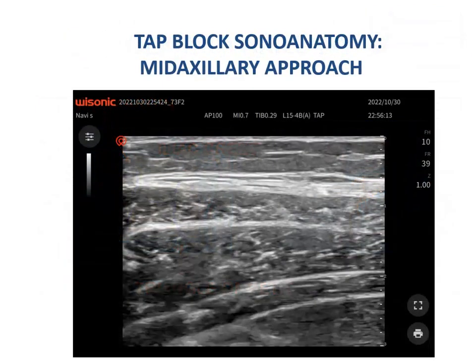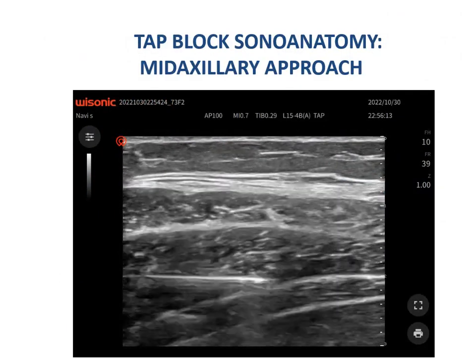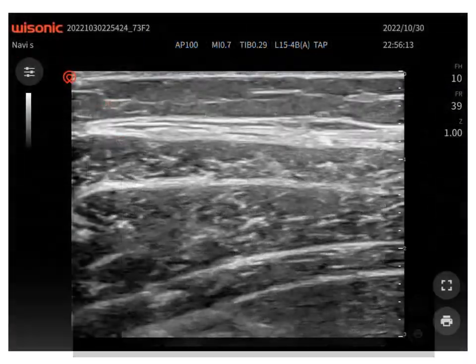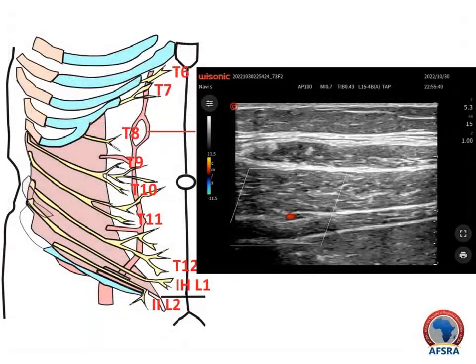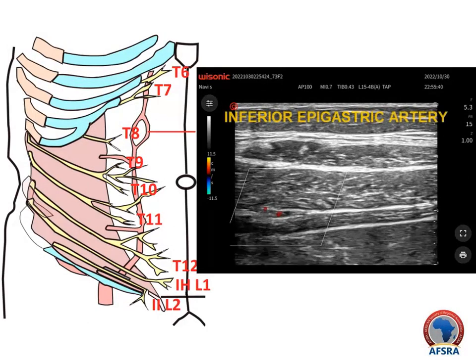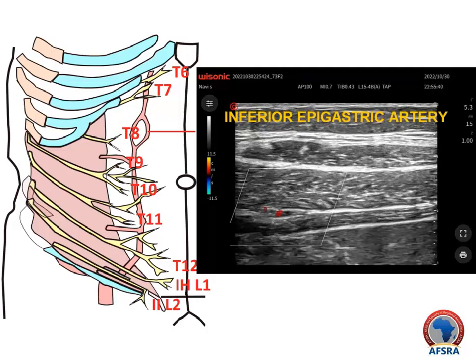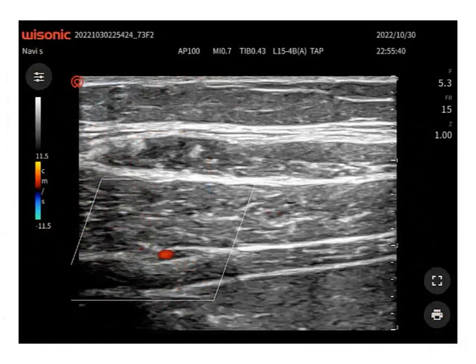The superior epigastric artery enters the rectus in the subcostal region near the xiphoid process. From below, the inferior epigastric artery enters the rectus sheath. When performing TAP blocks, color flow Doppler should be used to identify these arteries or their branches in the planned needle path before needle insertion.